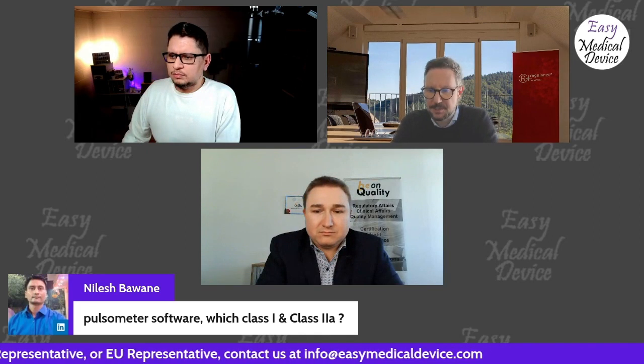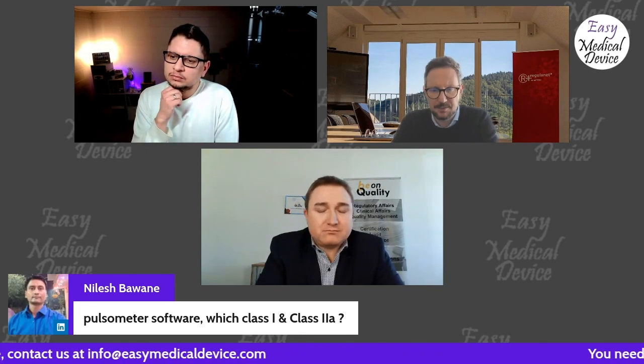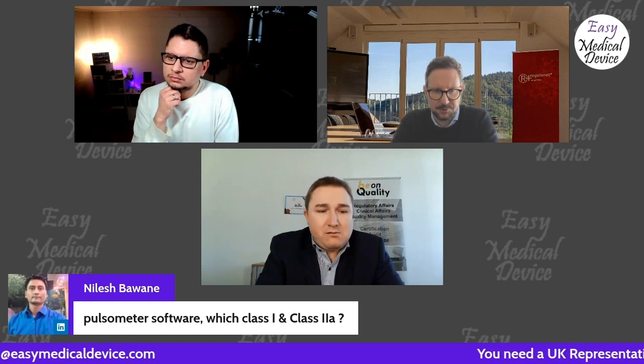Okay, so the intended purpose, the intended use, we really have to do this exercise so that you are qualifying these things correctly. Maybe Munir, some examples for class 1? The typical ones are these cognitive behavioral therapies, which I mentioned. These are usually class 1, unless, of course, the indication is critical.